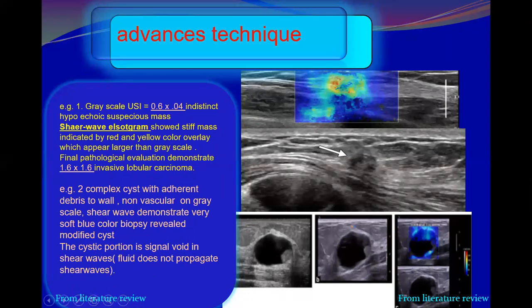Regarding this case, Dr. Rabab, I could see a small tiny area in the wall of the cyst. Its color is green or light green. Should I take it or neglect it because it is so tiny? They consider it soft, generally, because predominantly it is just blue, you see? So they found it just a complex cyst. Okay. Thank you, Dr. Rabab.